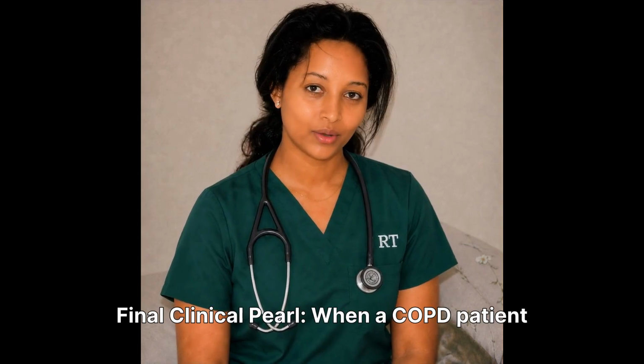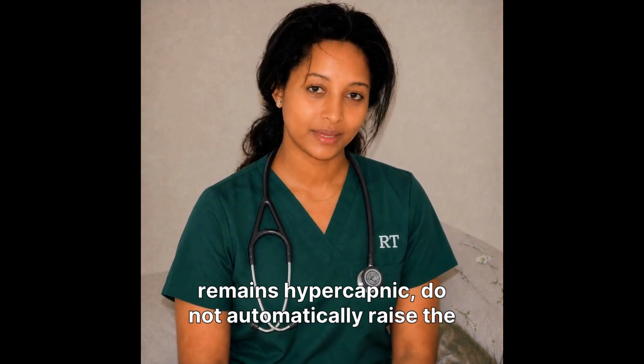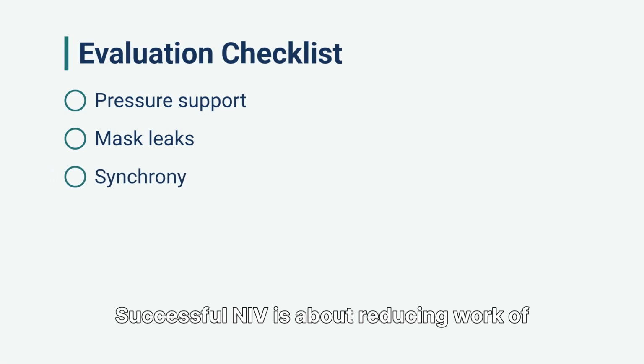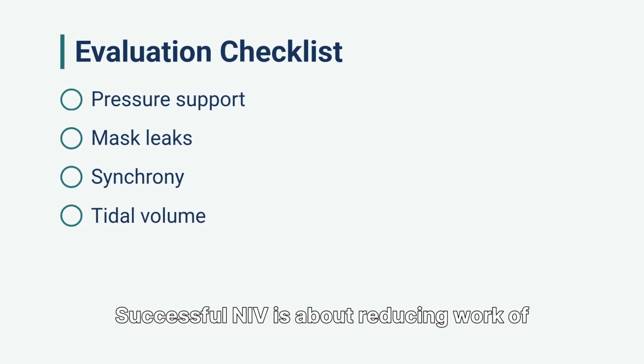Final clinical pearl. When a COPD patient remains hypercapnic, do not automatically raise the backup rate first. Instead, evaluate pressure support, mask leaks, synchrony, and tidal volume. Successful NIV is about reducing work of breathing.